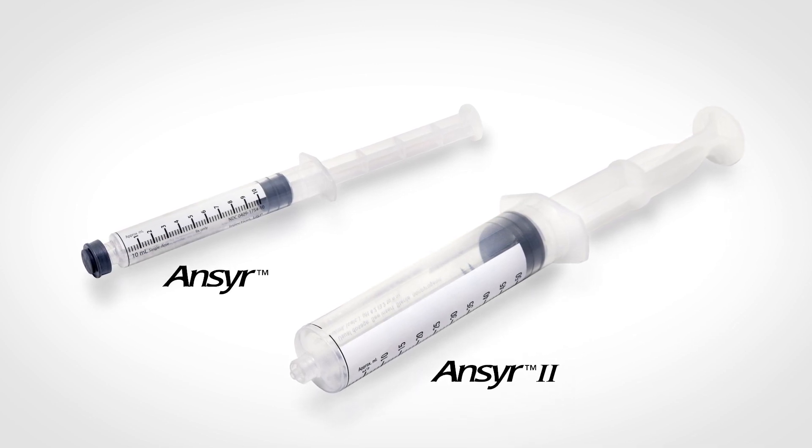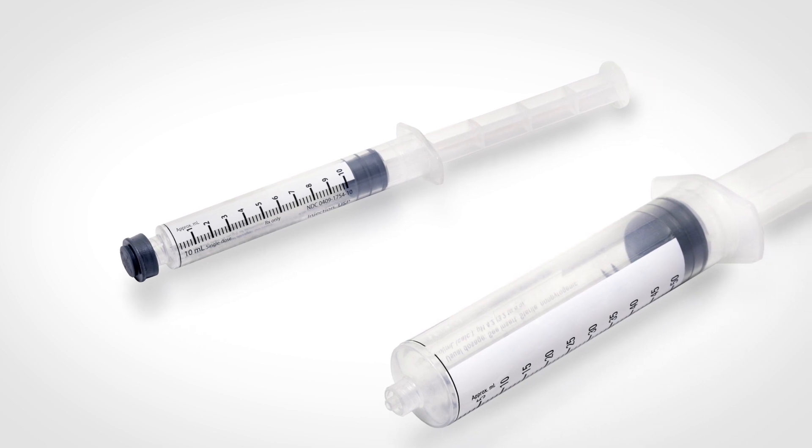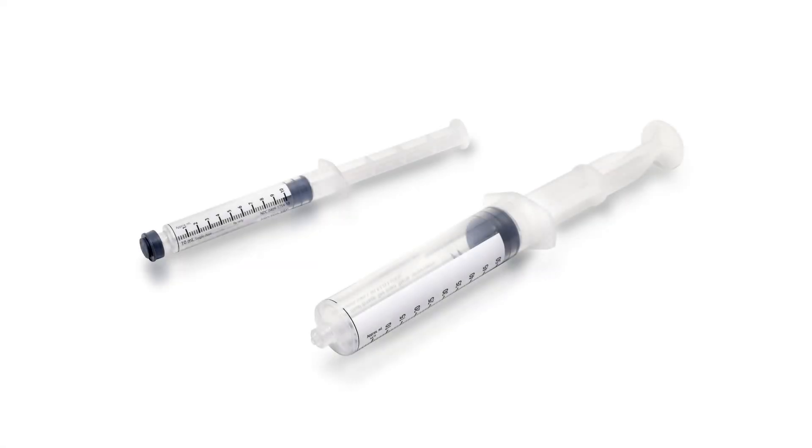Both products feature a proprietary delivery option offering efficient medication delivery in emergency, trauma, and critical care settings. A few key advantages of Answer syringes include a Luer lock tip compatible with any IV system.